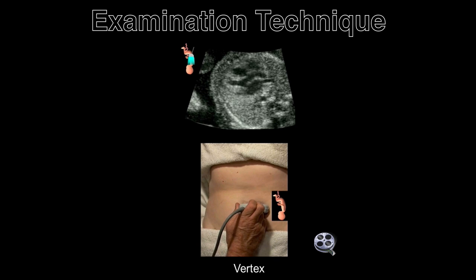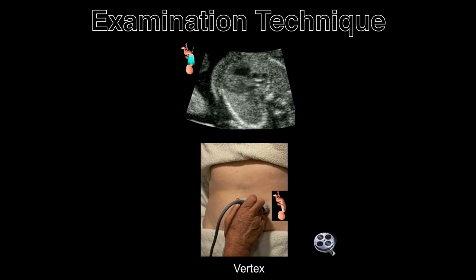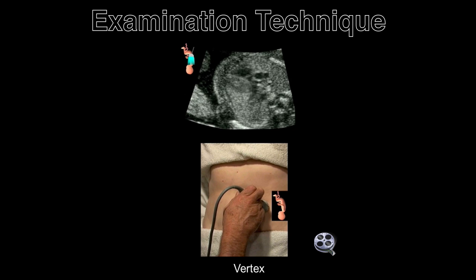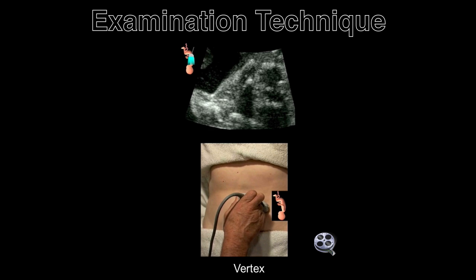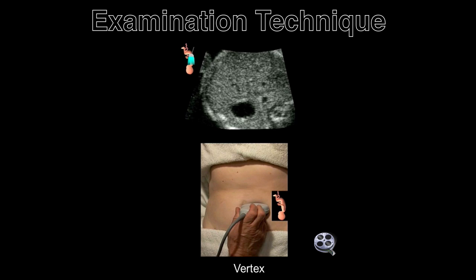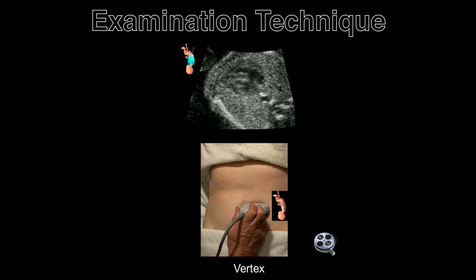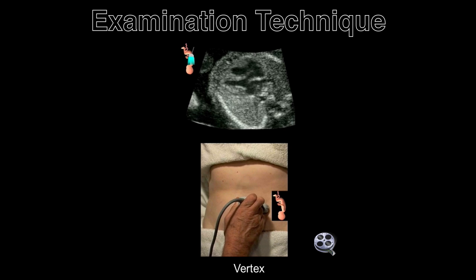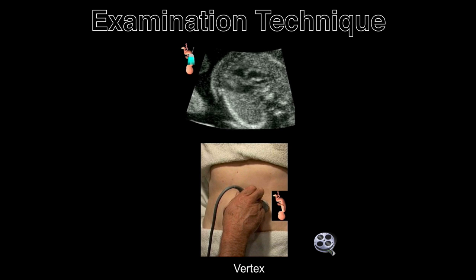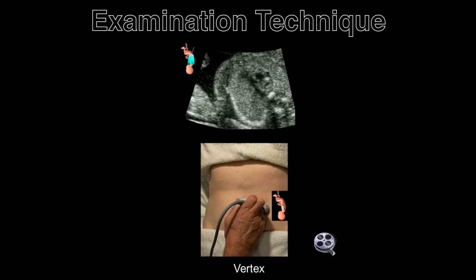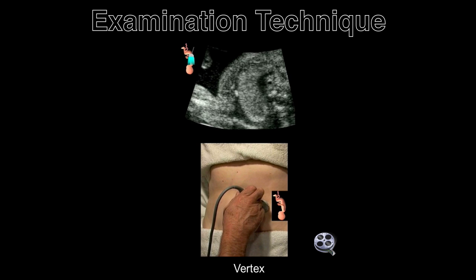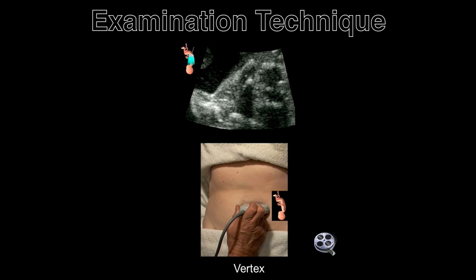Detection of congenital heart abnormalities requires the examiner to evaluate the four-chamber view and the outflow tracks. The easiest method is the transverse sweep, in which the examiner identifies the four-chamber view and directs the transducer beam towards the fetal neck. This scenic clip illustrates the movement of the transducer to obtain the views of the fetal cardiovascular system when the fetus is in the vertex position. A similar motion of the transducer beam would occur if the fetus were in the breech position.